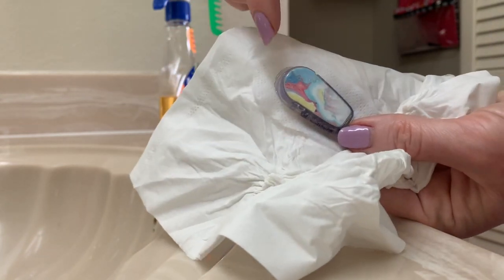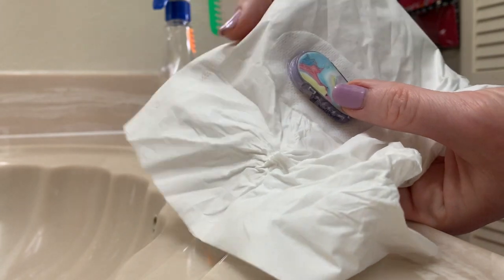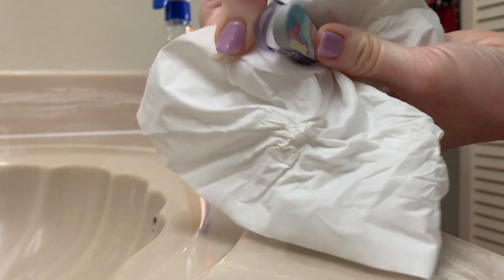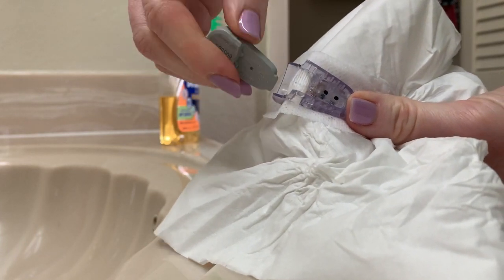You'll notice right here at the top of the sensor there's like a plastic lip. I've got it stuck on a tissue. You get a hold of that plastic lip and you break the sensor in half. See how I've broken it? Then the transmitter just slides right out. Quick and easy.